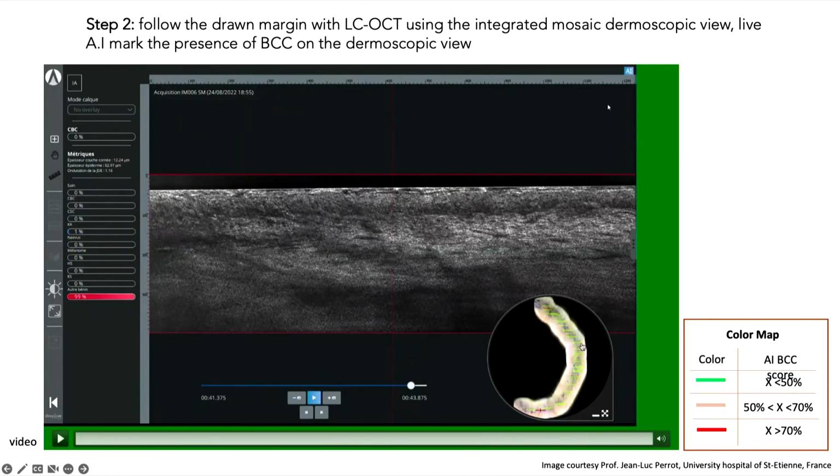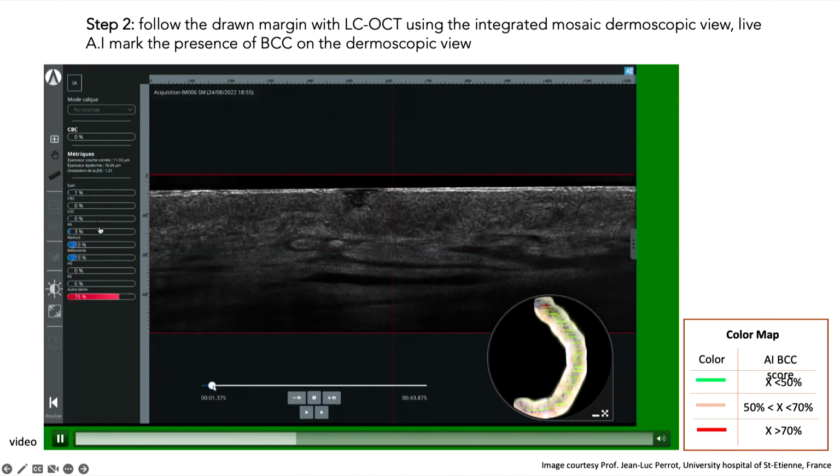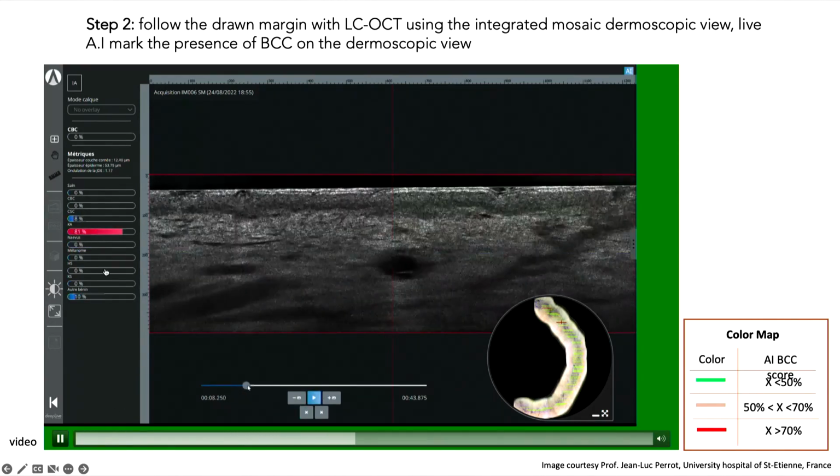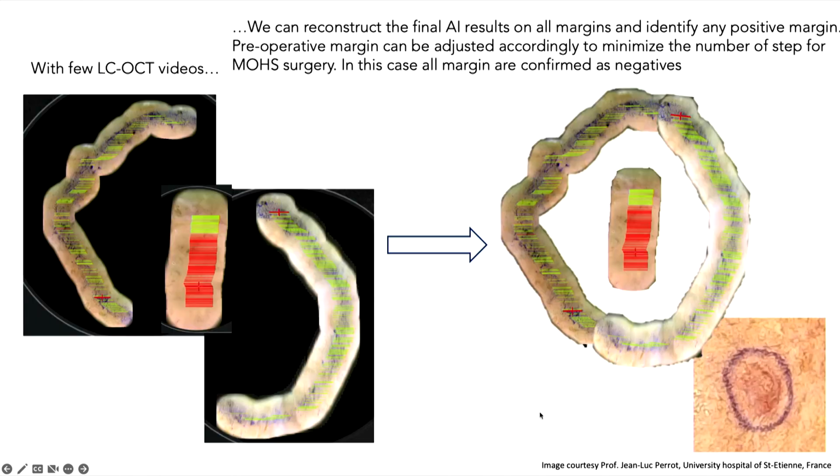So we're moving around, as you're seeing here, and everything is green. Can you see here? It's green, there's no tumor presence. And you are going to see in the next one. So green, we don't have tumor. We have here also the comparisons. Everything is perfect, no tumor, everything is green.